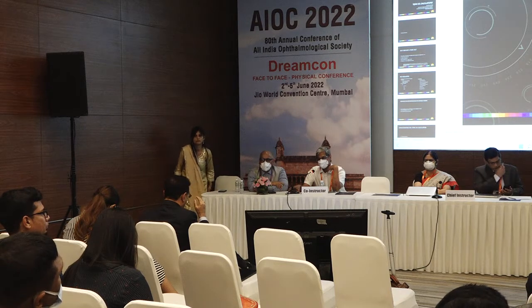The flattening area that happens in RK can be from 2 to 3 to 4 millimeters, but you are worried about the central 3 millimeters or less. The smaller the zone you measure, the more likely you are to be accurate. So in post-RK, take the K reading from the Pentacam? Yes, or whatever topography will give you the central 2 millimeters or so.